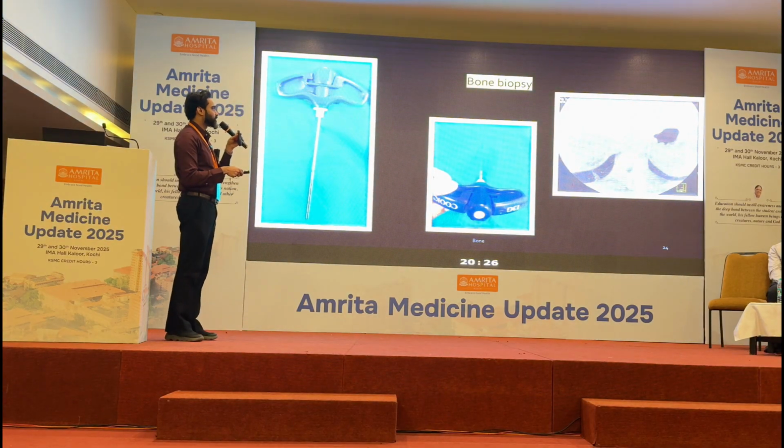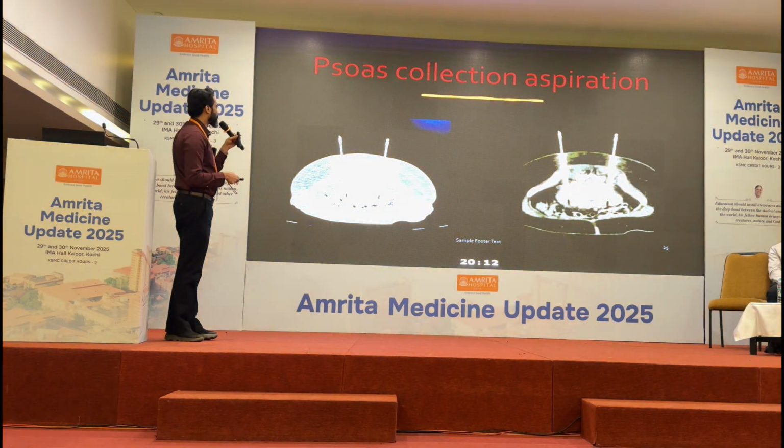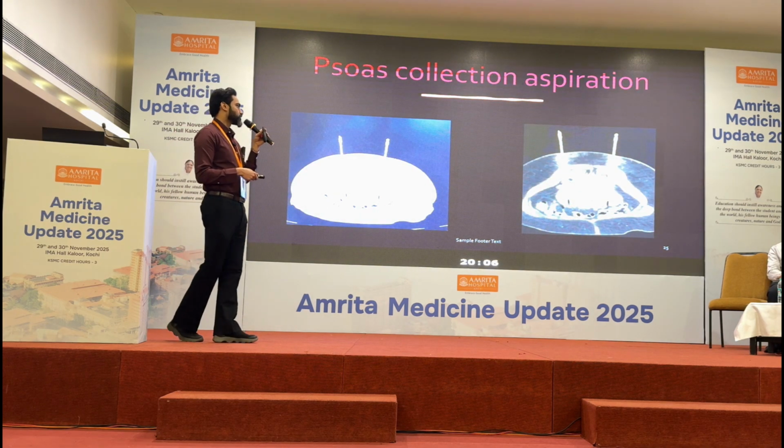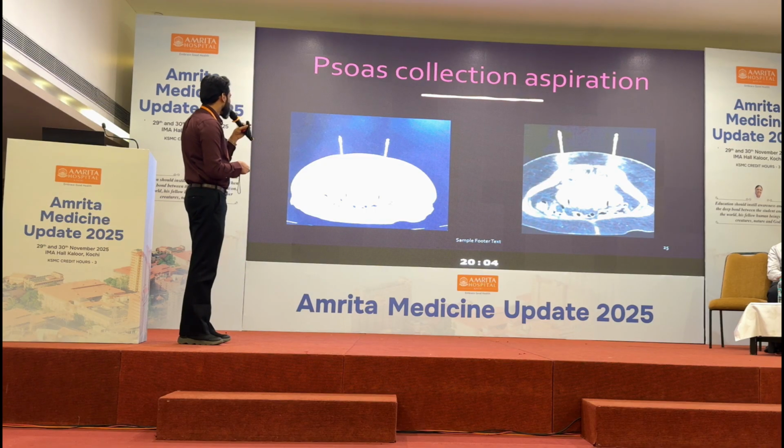That's a transpedicular biopsy for a suspected metastatic lesion in the D9, D10 vertebral body. Under fluoro guidance, we take a transpedicular approach to enter the vertebral body and then take biopsy from that. This is a patient who is suspected to have tuberculosis. She had collections around her psoas. So this is simultaneous needle positioning into both her psoas collections, and pus was aspirated.